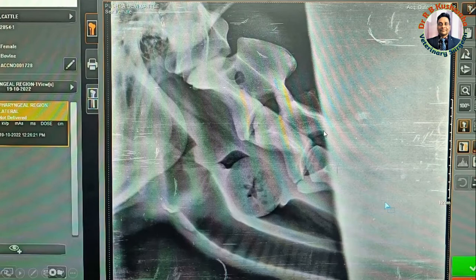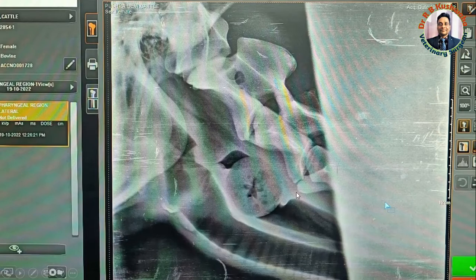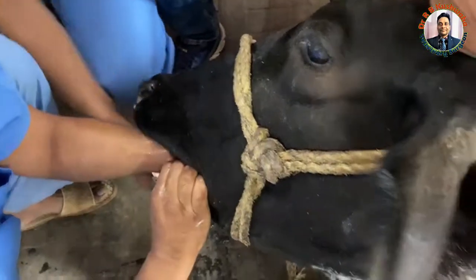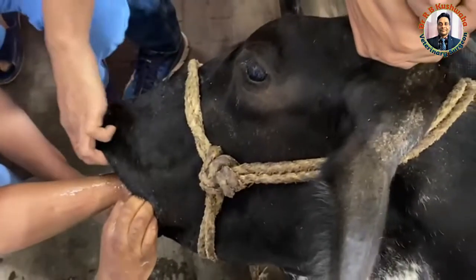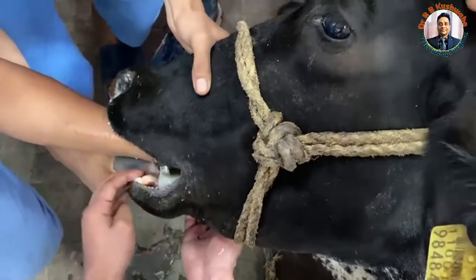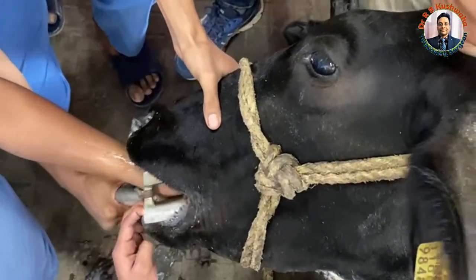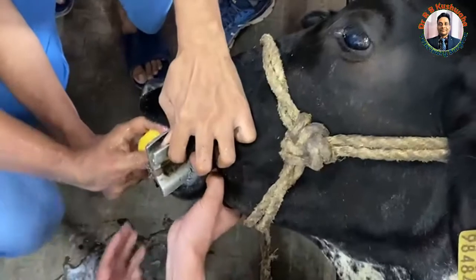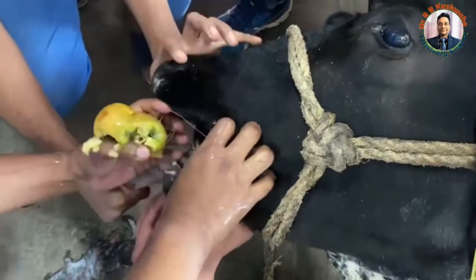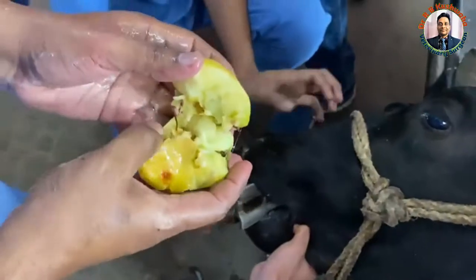Immediately after diagnosis, since the foreign body is present in the pharyngeal region, our intention was to remove it by hand. We placed the animal in lateral recumbency and administered 3 ml of a mixture of xylazine, butorphanol, and ketamine in the ratio of 1:2:3. We then placed a mouth gag on both the right and left sides.